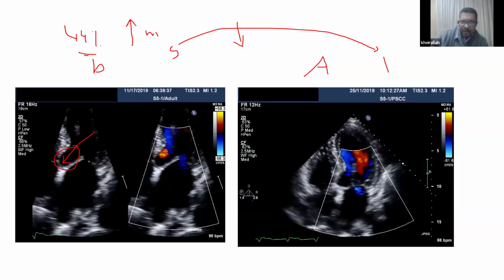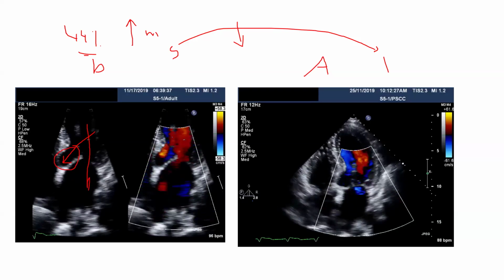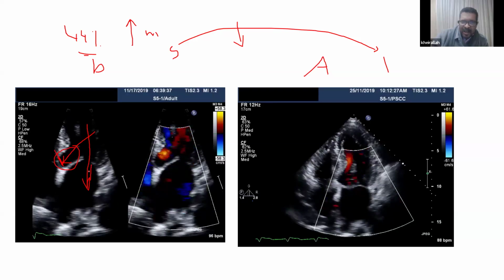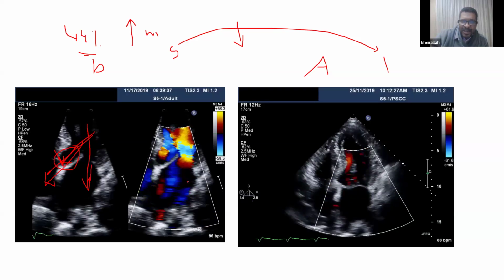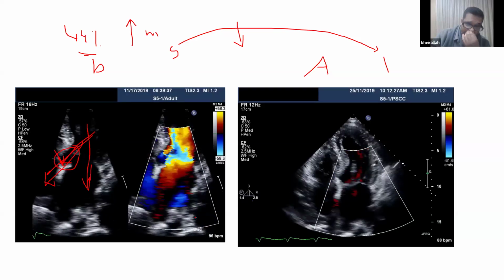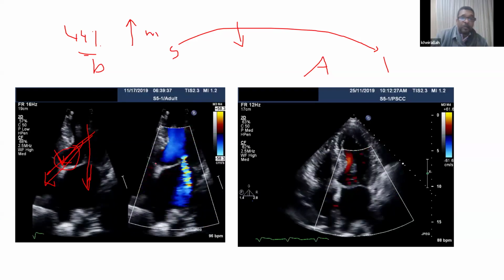the blood is going to go in this direction, because the afterload is very high. So it's venting the afterload through the mitral valve. If you open it here, you ease the afterload, and you are going to ease the problem on the mitral valve. Therefore the changes happen in 44%.